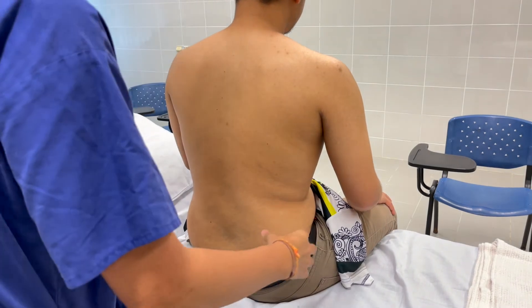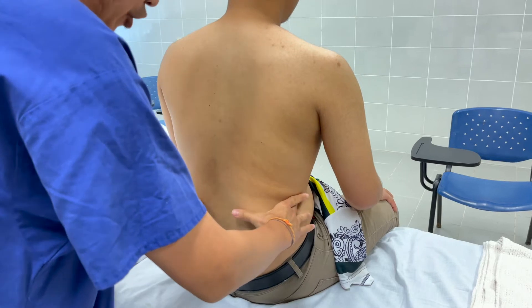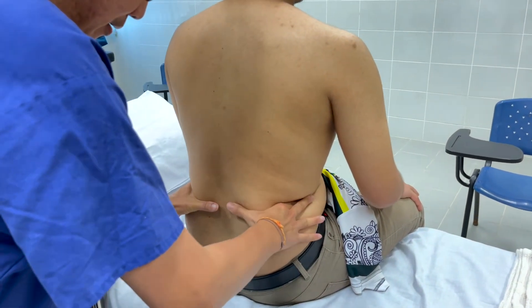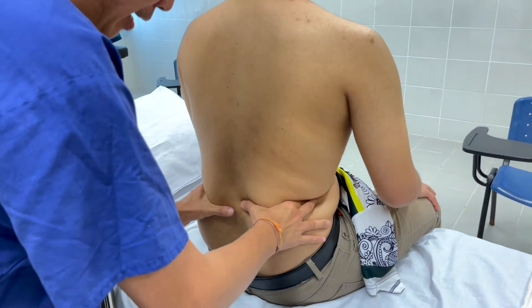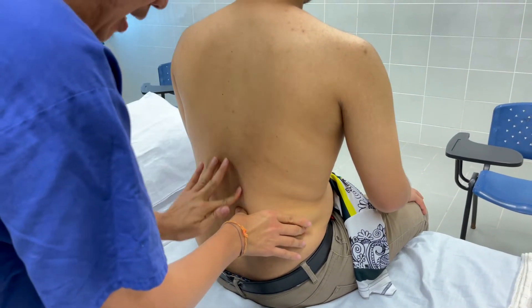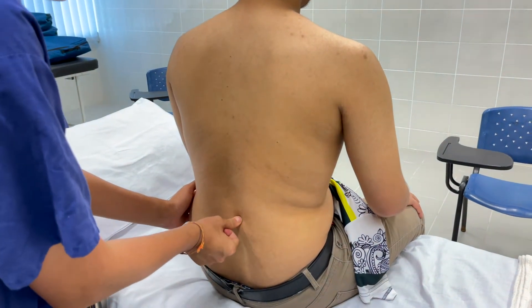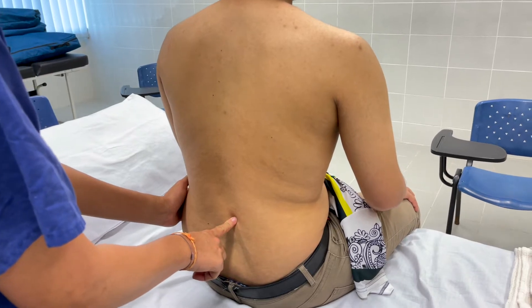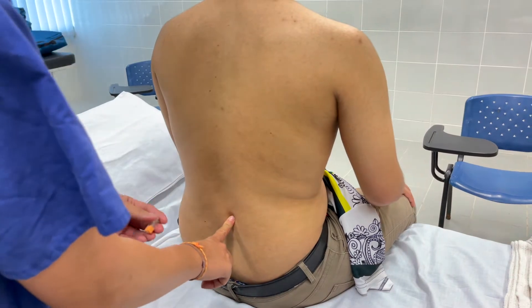Sorry sir, I would like to feel for your posterior superior iliac spine. It's a bit itchy — usually it's around this space. You feel for an indentation over the area, and it is the midline — at the L4-L5 area. This is the location where I will be inserting my spinal needle.